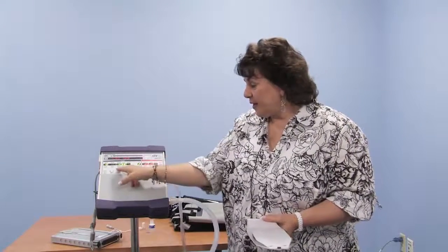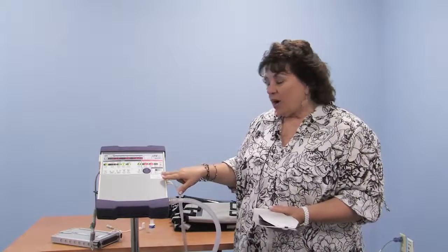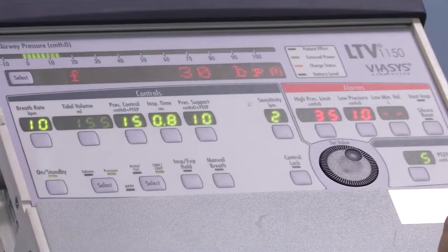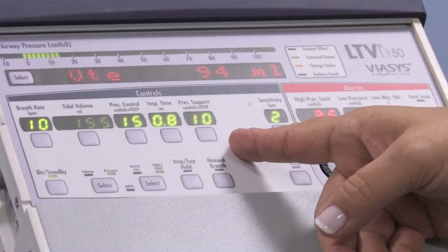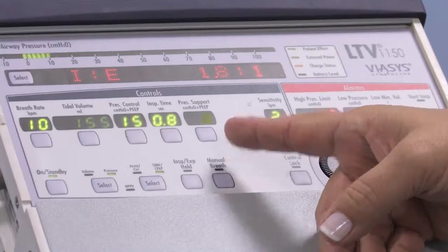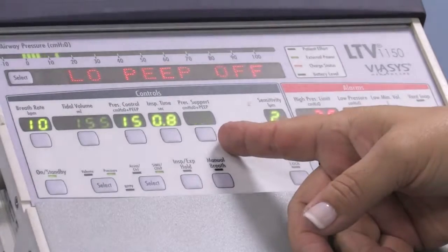We are now looking at the LTV 1150 with the same settings as we had on our patient on the 950 ventilator, but what you notice are different numbers here under pressure because our PEEP is now internally set. So our child that was on the 950 ventilator that we demonstrated a few moments ago was on up to 20 and down to 5, a difference of 15 centimeters of water. On this machine, we set the 15. The pressure support on our other ventilated patient was up to 15 and down to 5. The amount of pressure support, or help for the breath size, was 10 centimeters of water. We're actually setting the 10.